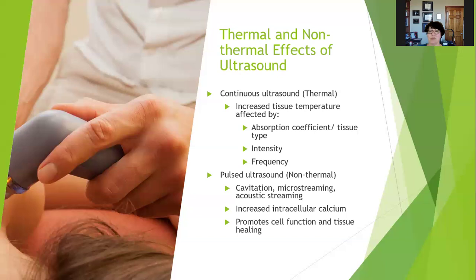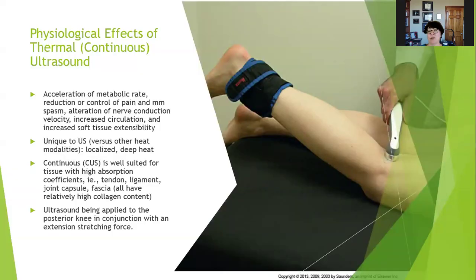So sometimes you will run across a patient in the clinic that'll say, "Oh, I had ultrasound one time and it was really helpful for blah, blah, blah." They're not going to feel accelerated healing and improved cellular function. They might feel warmth, but as a sort of pain management technique, ultrasound is not usually your choice. You're usually doing ultrasound for increased tissue healing, or maybe for a deep heating effect, to warm up for something else, but you're not generally using ultrasound to address pain. So if somebody says they had pain relief from ultrasound, good for them. But that's not one of the indications that we're generally talking about with ultrasound.